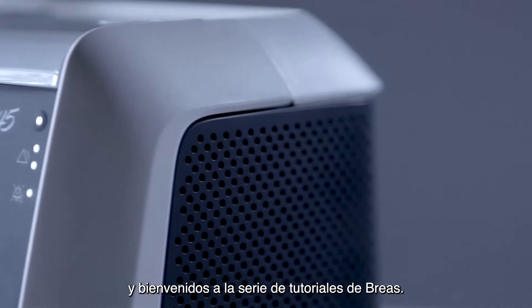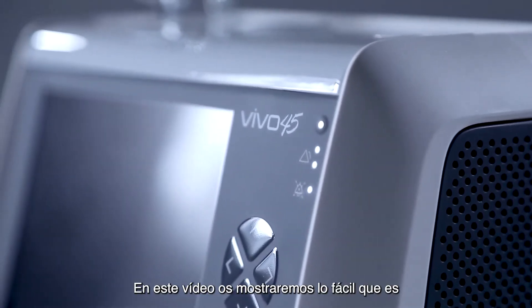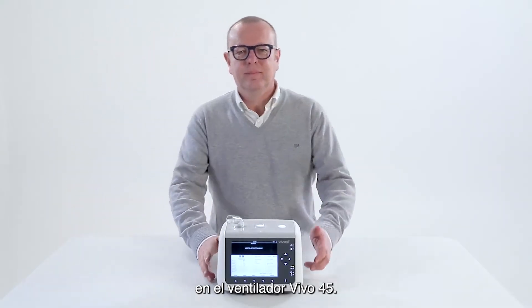Hello and welcome to the Breas tutorial series. In this video we will show you how easy it is to select and set a ventilation mode on the Vivo 45 ventilator.